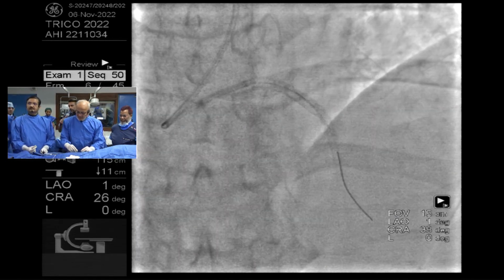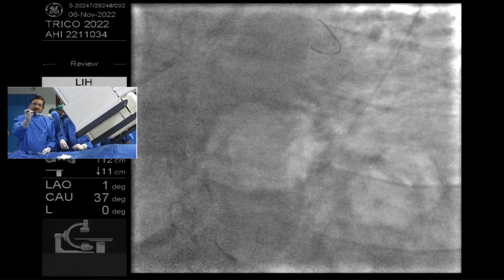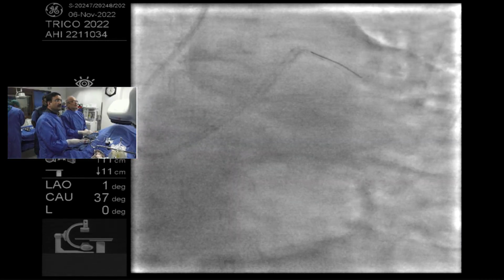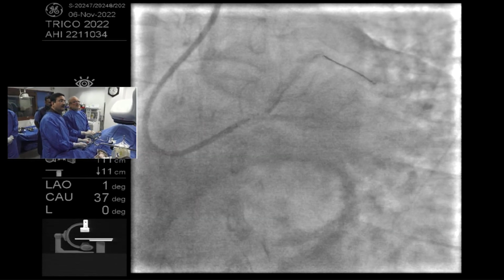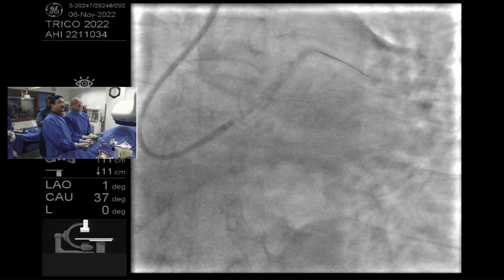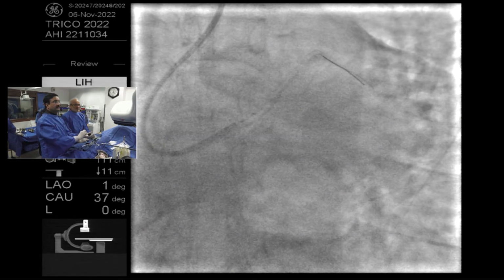In this scenario, if I put my stent in the left main ostium, does it give me more freedom for over expansion of the stent in the left main? I think one should do optimal expansion rather than thinking of over expansion every time. Okay, Sanjay, this looks good. Right, so here we can go at 15.